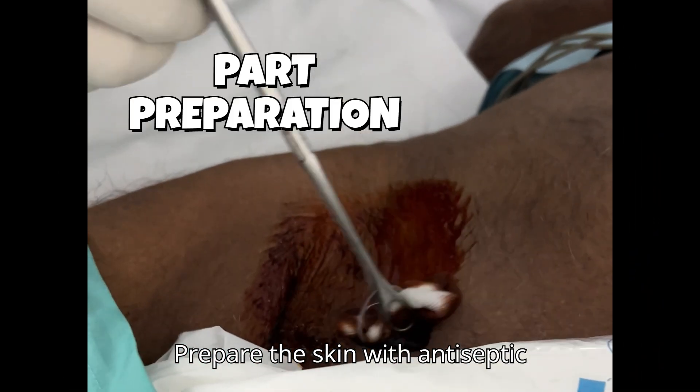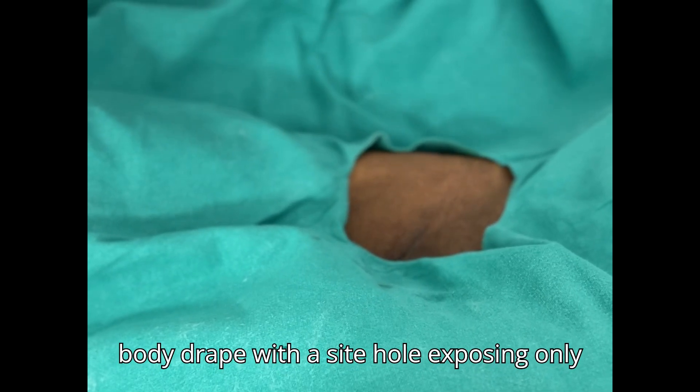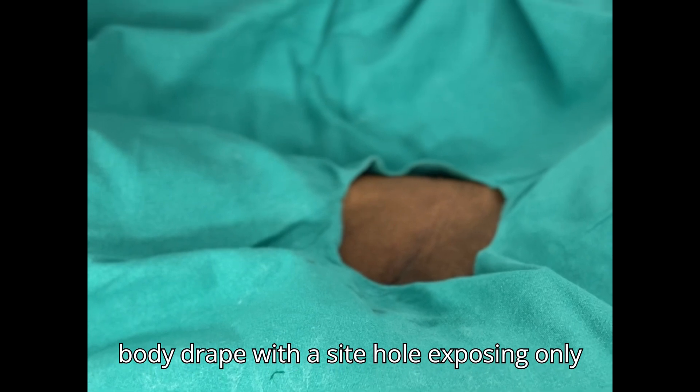Prepare the skin with antiseptic solution, for example povidone iodine, and use a full body drape with a side hole exposing only the necessary skin.